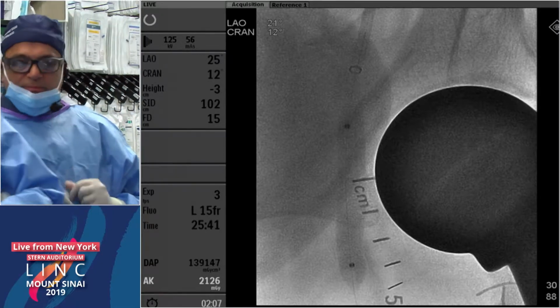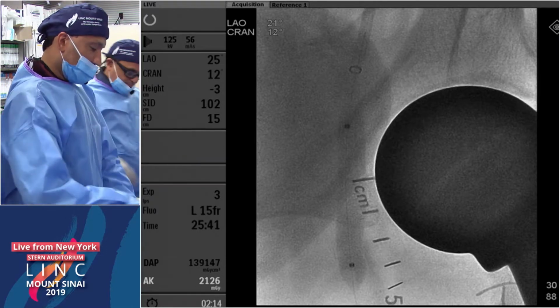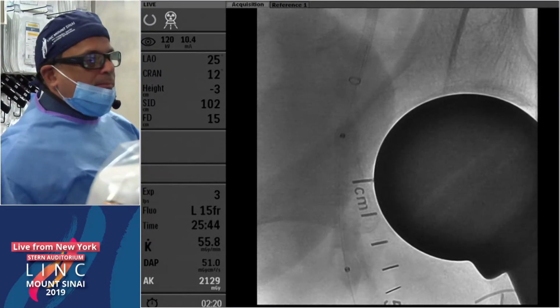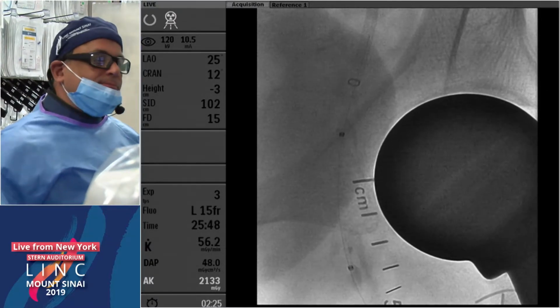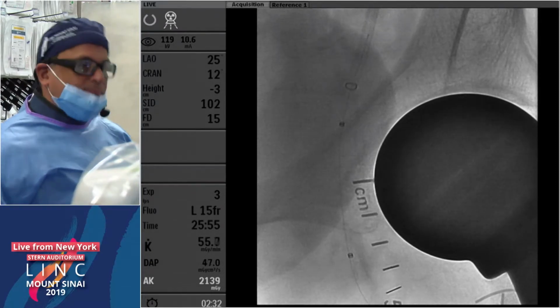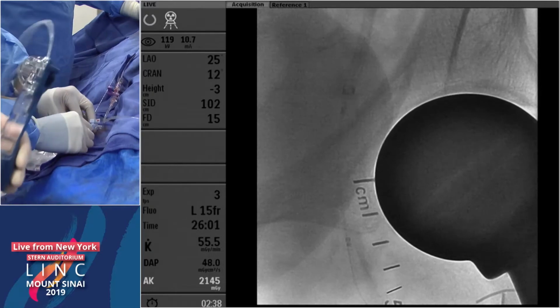That's a good point as well, that we're having impaired outflow here, so that convinces me at least better. Those concerns are valid. But I agree, PK, I think it's an excellent case because it is really a very favorable case for endovascular in general, whatever you do. I think many of the cases are probably more complex, involving the bifurcation, and can still be done with the concept you suggested, atherectomy plus DCB.